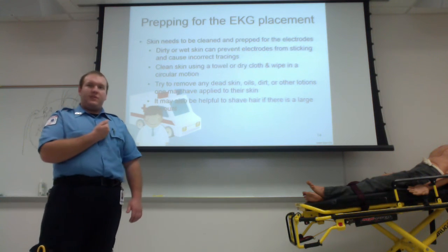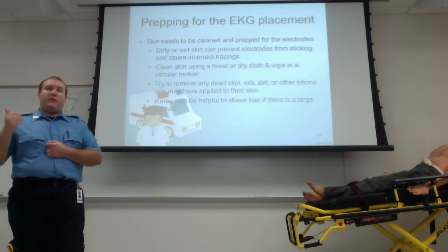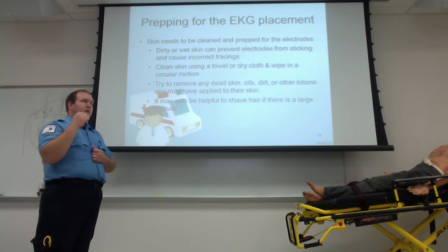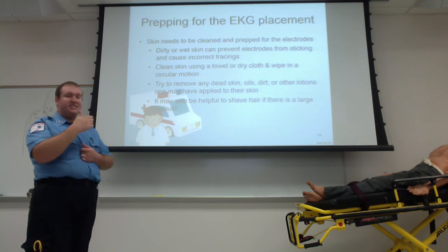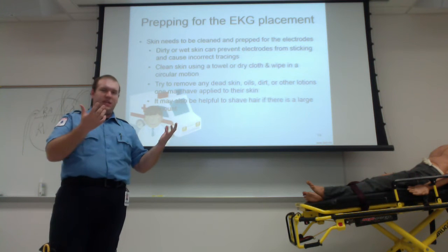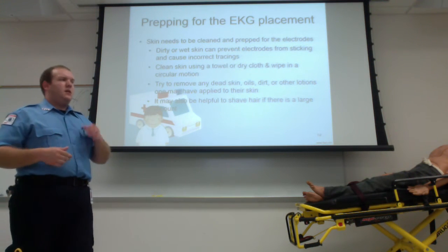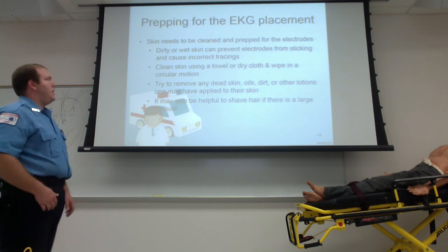Now that we know what we're looking for with that elevation, it's helpful if our monitor can actually pick it up. And so that way we can say, okay, we know what we're doing here. We can see that with a highly filtered monitor or a tracing machine, you can't see that. So today they're not quite as filtered, but you can see more with them because of that.